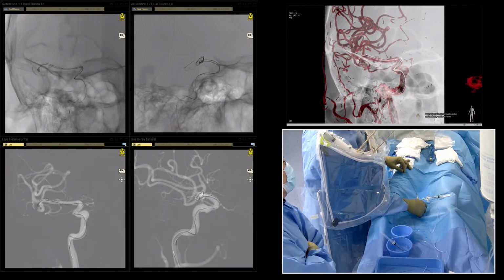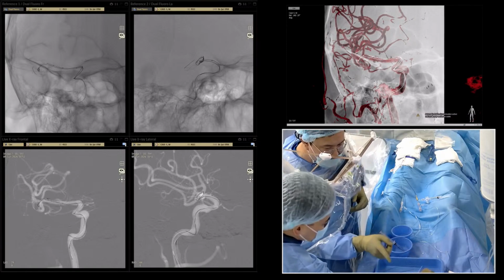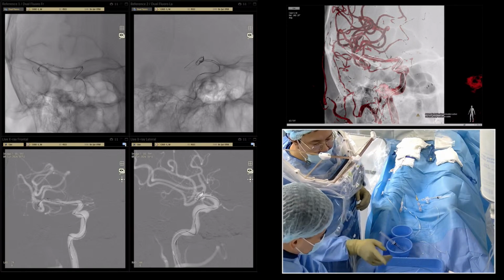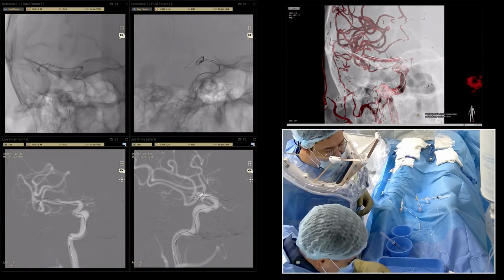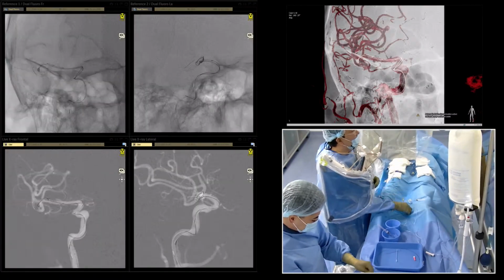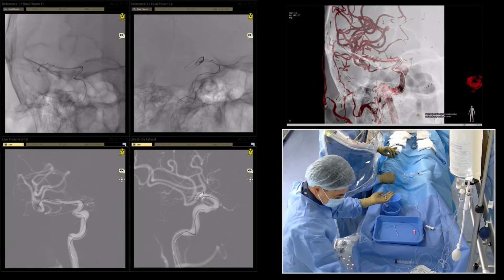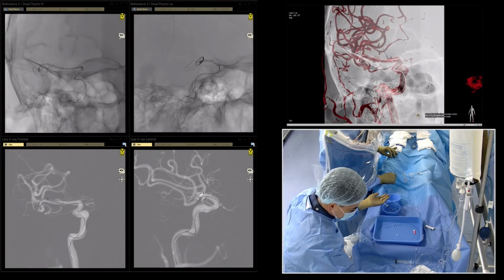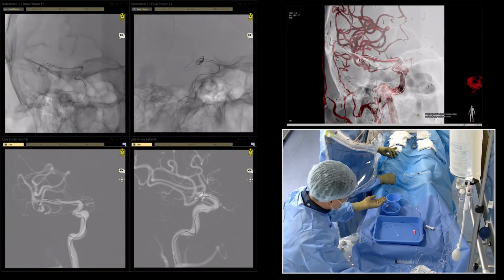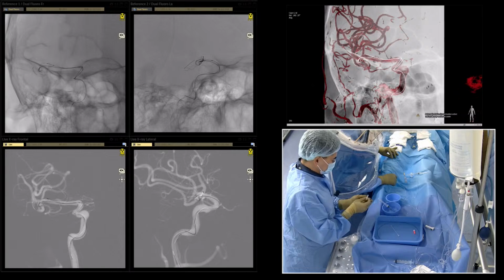And it might be this stent is still attached to the delivery wire because of the torque. Because of the angulation, it might be still inside. It's okay, it's around the stent, but I will prefer to move a little bit more in the aneurysmal part.